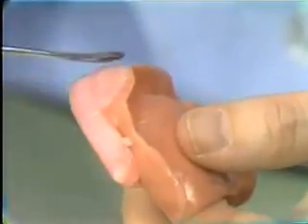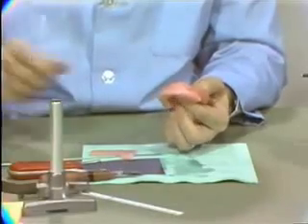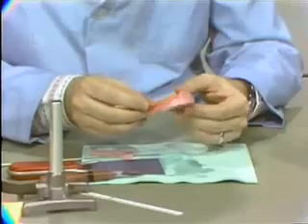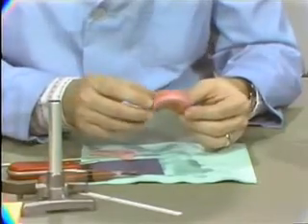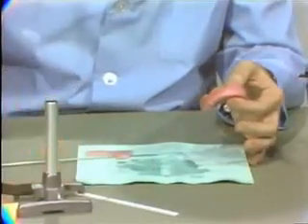We'll take another look at this labial inclination of the wax rim in a couple of moments. So this does take a little work. It's not simple, it's not easy, it's not too fast. So be patient and work with these bite rims until we come up with a desirable final product, which I can show at this time.